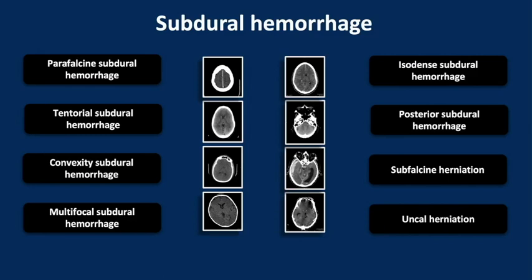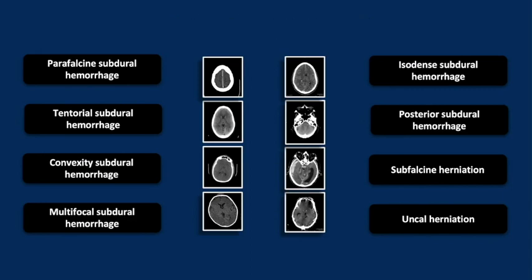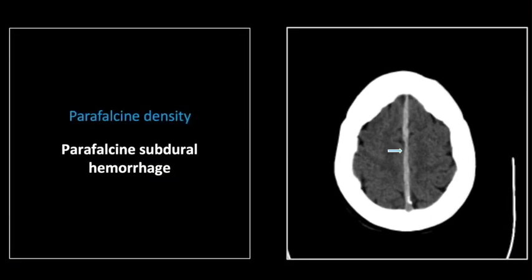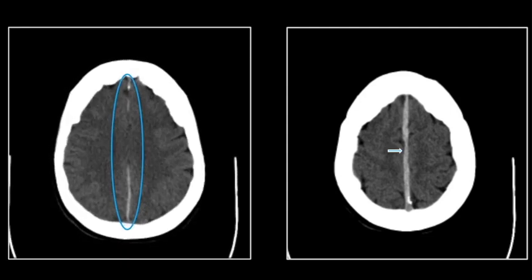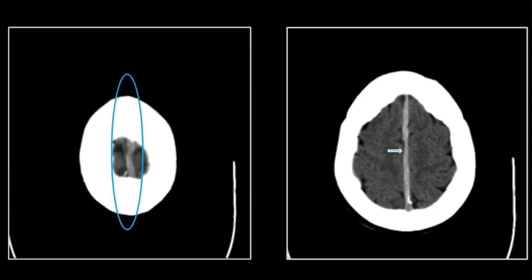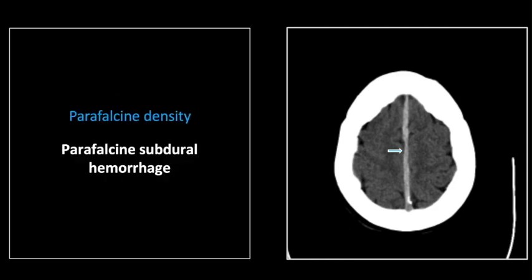Our topic for this session will be subdural hemorrhage. Our first case is a relatively straightforward case of a parafalcine subdural. You see the widening and increased density of the falx, which generally is at least somewhat dense. Here you can follow it throughout its course. It is too prominent, but certainly these are missed with some frequency. Again, a classic case of a parafalcine subdural hemorrhage.